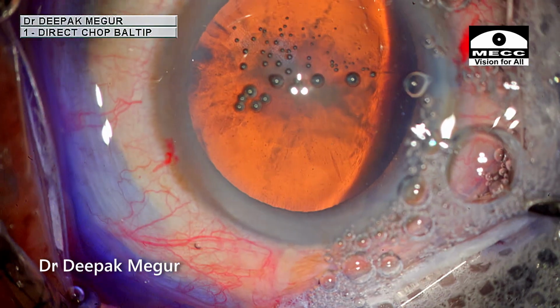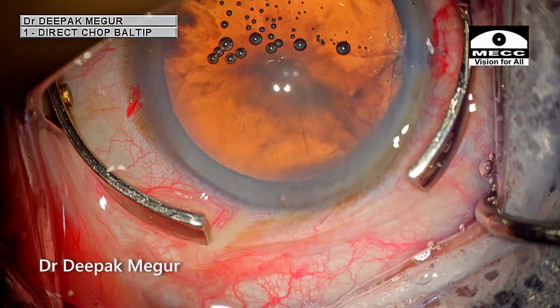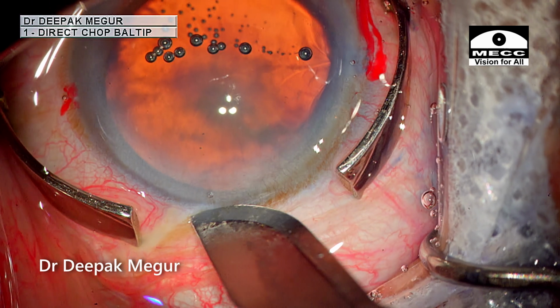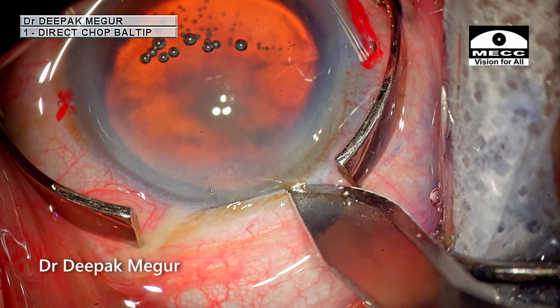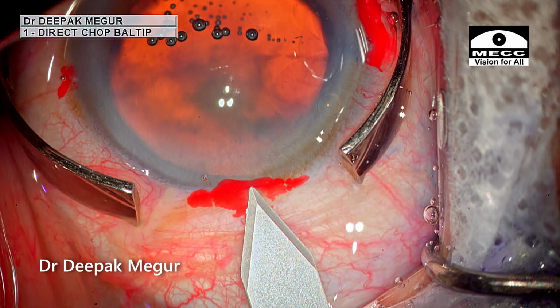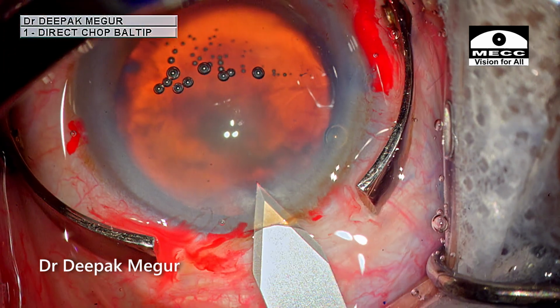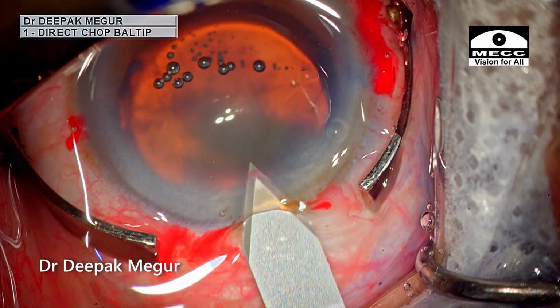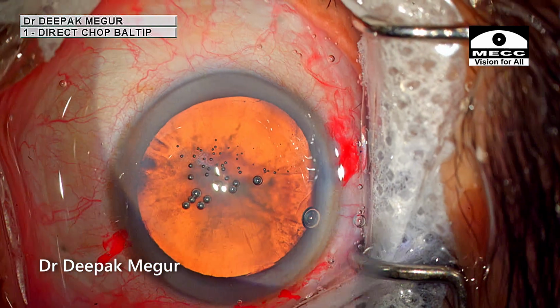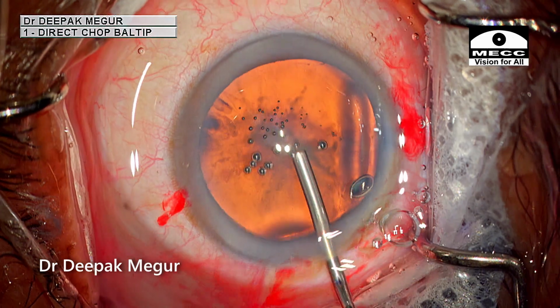The patient is quite comfortable here. Again, I'm performing the main incision, stabilizing the globe. I'm using a 15 number blade to make the initial groove, and using a 2.8 millimeter keratome, I'm trying to create a tri-planar incision. So the incision is done, and I just want to remove those air bubbles before I start doing my rhexis.